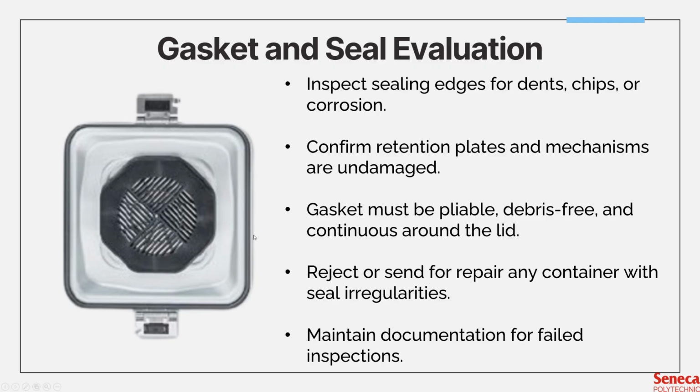So you will have to check the gasket and ensure that there are no cracks, no tears, no punctures to the gasket. And of course, you have to ensure that the gasket itself did not harden after repetitive sterilization cycles. That is a very common thing you'll see with some gaskets that have been used for a very long time. Eventually, the rubber it's made out of will harden, which makes it not pliable. It's not as soft as it should be.